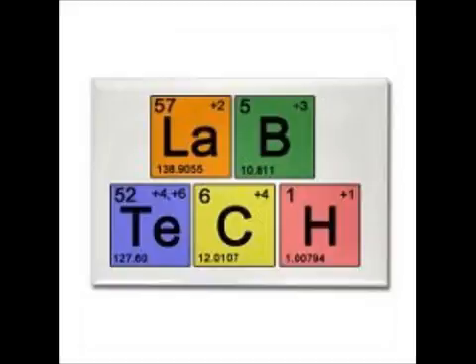But the 750s, if you have a lipemic or a very greenish yellow sample, you better have a backup, like the fibrometer, to do the ProTime and PTT. It'll give you abnormally high results, and it's all because of the color of the plasma. Now the machines are so good, I don't know anybody, even with optical density, who has any backup, because it can detect the slightest change. But this is the classic test for 13. So if you see normal protime, normal PTT, abnormal 5 molar urea, that sums up 13.